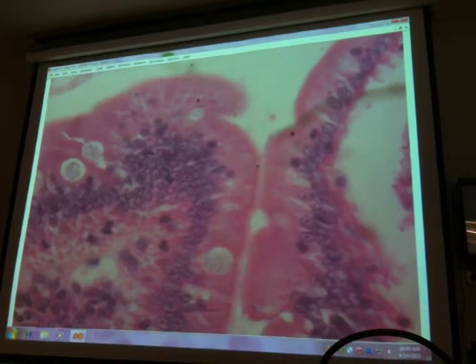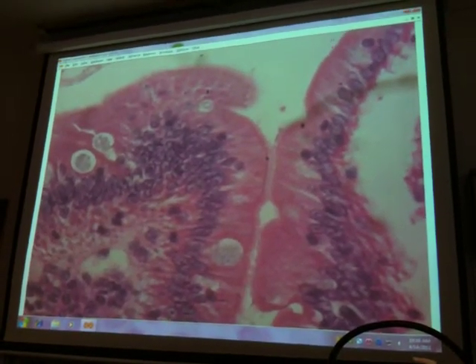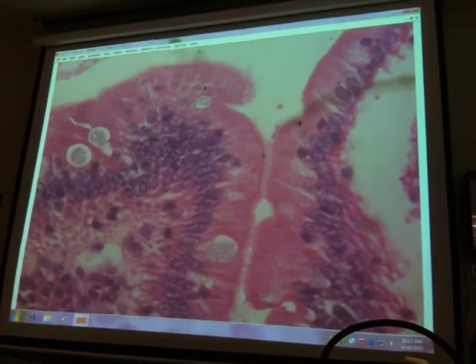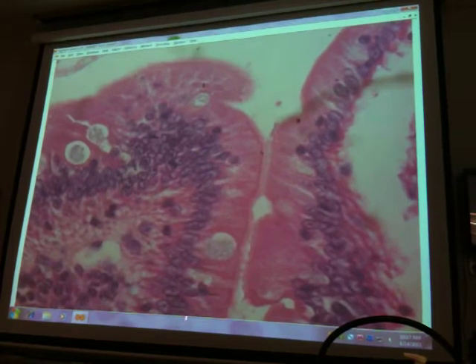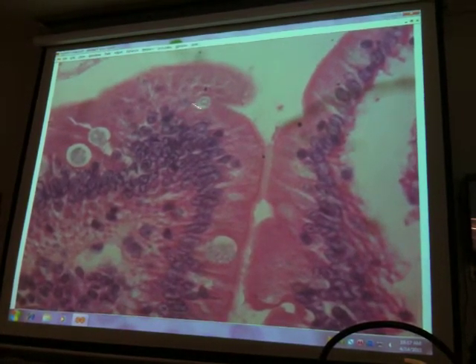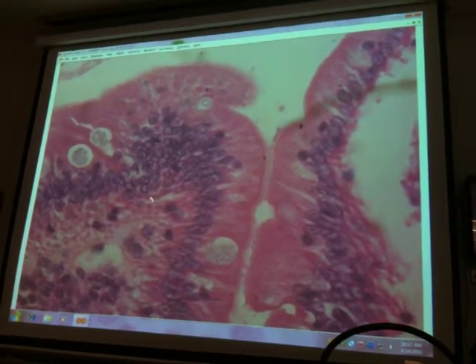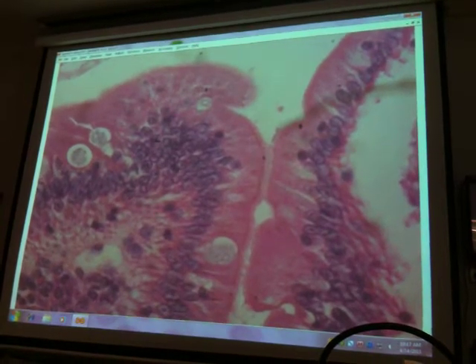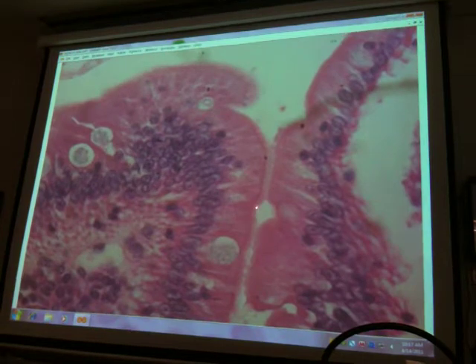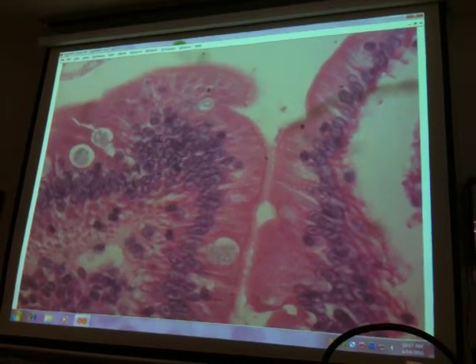Those are actually microvilli. Sorry, can you point out the villi again versus the microvilli? Well, the villus, we're going over the top of one right here. We're going over the top of a very short villus right here. So the mucosal epithelium goes over the outside of the villus, and the inside of the villus is filled with lamina propria. The microvilli are features of the cells themselves, okay, at the free surface of the cells.